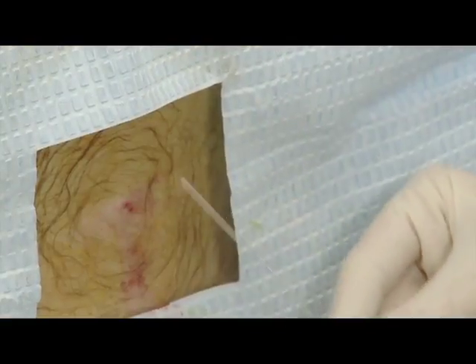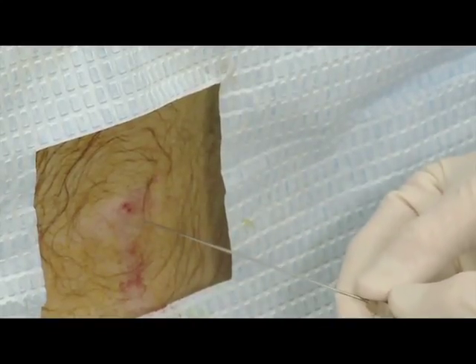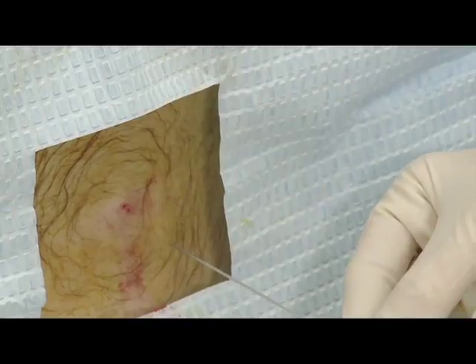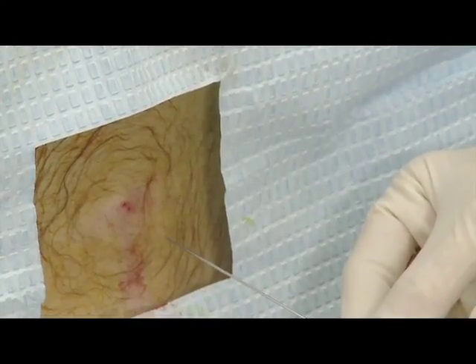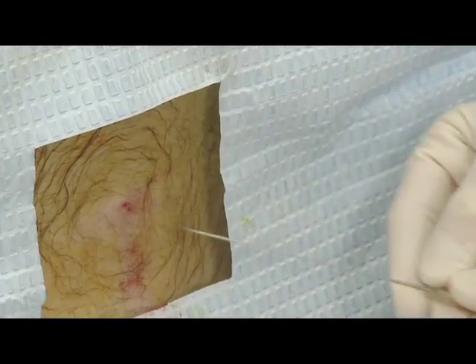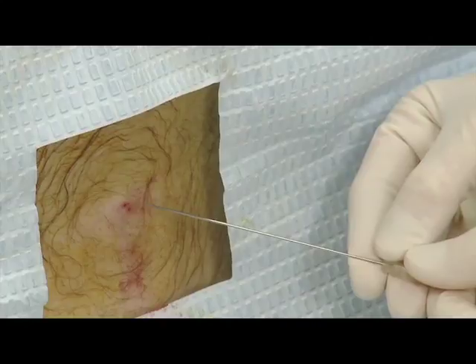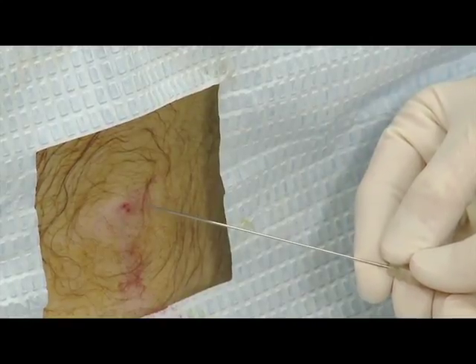Insert the spinal needle such that the bevel is in the plane of the longitudinal fibers of the dura, so that the fibers are spread and not cut. When the patient is in the lateral recumbent position, the bevel will be up towards the ceiling. If the patient is in an upright position, the needle should be turned so that the bevel will be towards the patient's side.